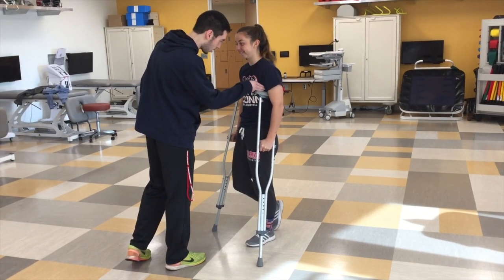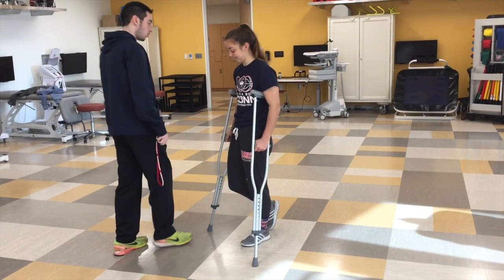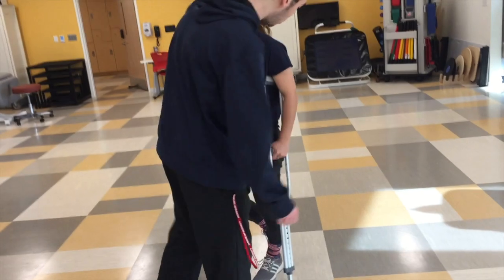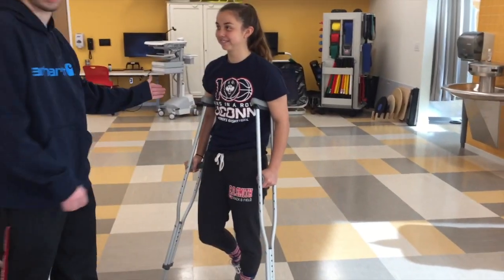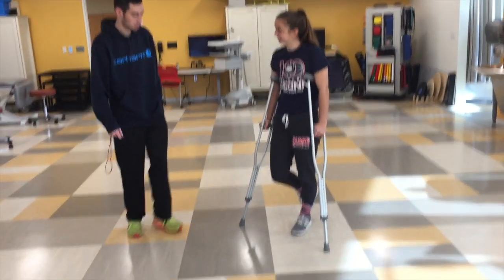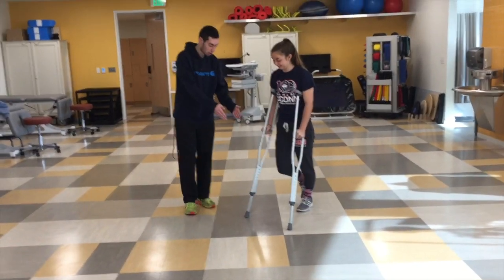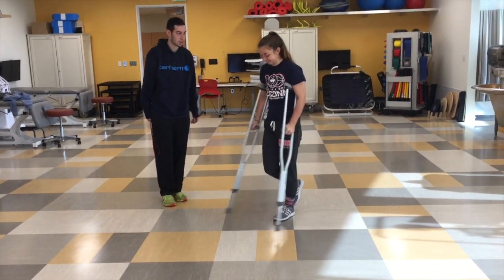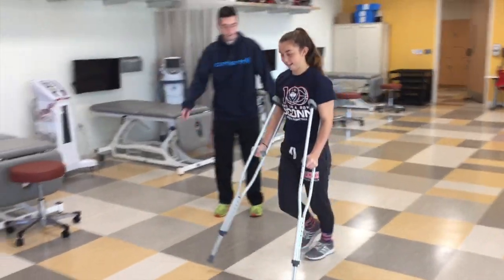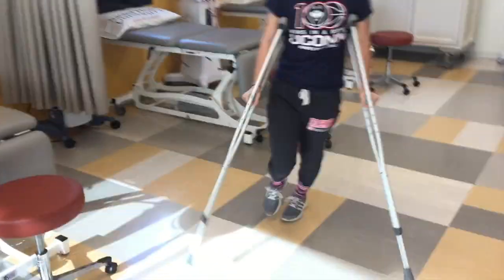Now it's a three-finger move. That's pretty good. Then we look for 15 to 30 degrees of elbow flexion. She has 15 to 30 degrees — that's pretty good. So now, what you're gonna do is put your crutches out and swing to the crutches first. Nice. Then, if you get more advanced, you can swing through them. Then you can keep going faster as you get better.